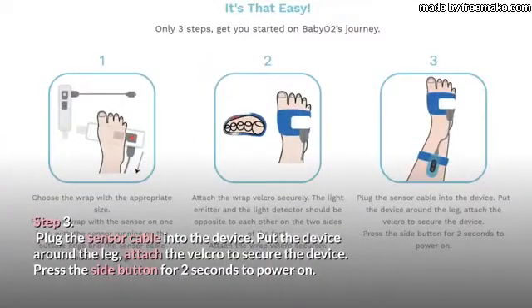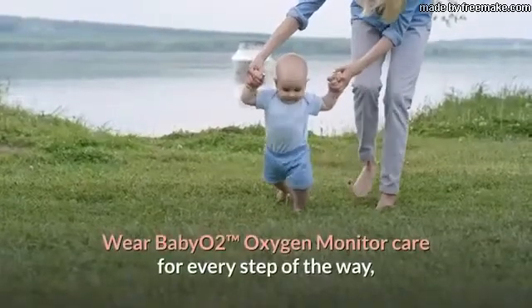Step 3: Plug the sensor cable into the device. Put the device around the leg and attach the velcro to secure the device. Press the side button for 2 seconds to power on.